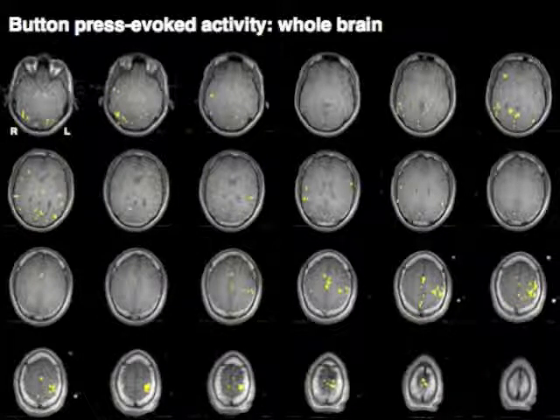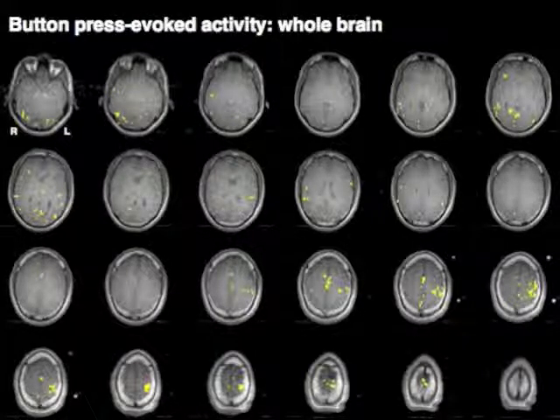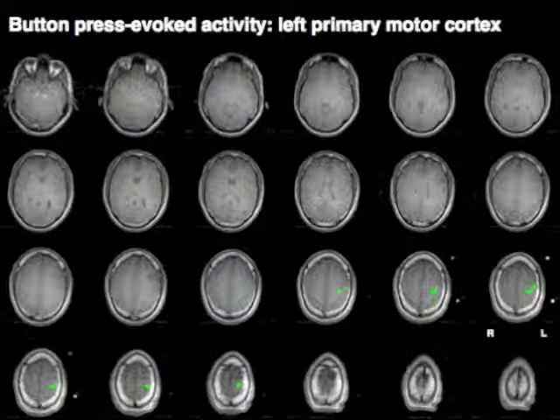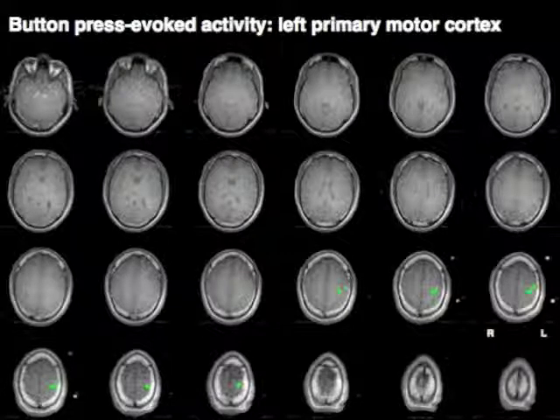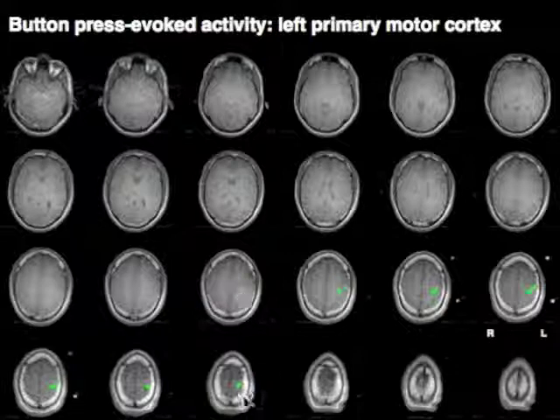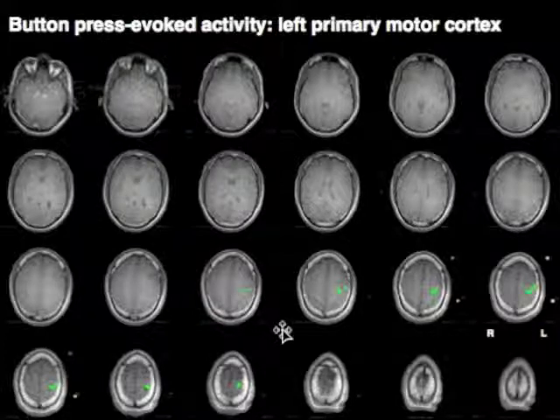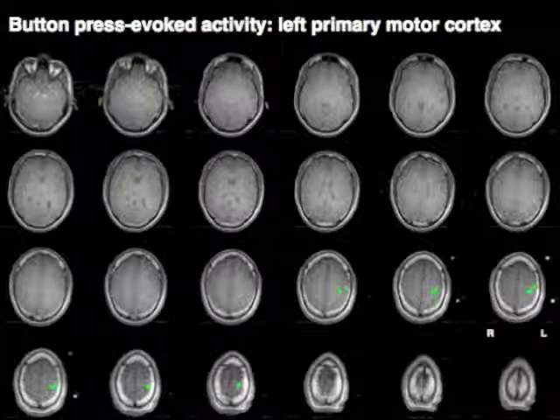and so what we're going to do first is mask out activity from regions that we don't think are directly involved in the behavior that we are measuring and when we do that now what I'm showing you is a region of interest that's restricted to the left hemisphere in the pre and post central gyri and so these voxels that are now depicted in green are the voxels in the left hemisphere sensory motor cortex that show elevated activity that is time-locked with the behavior that subjects were performing.